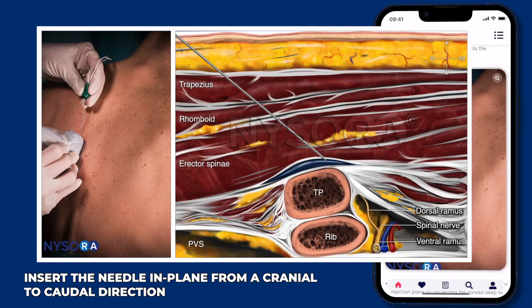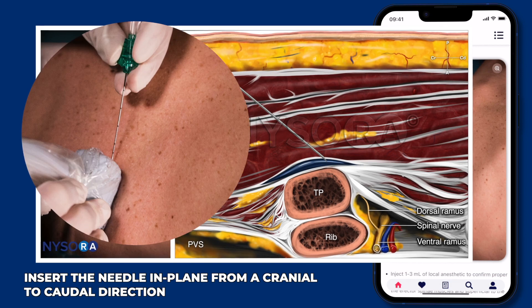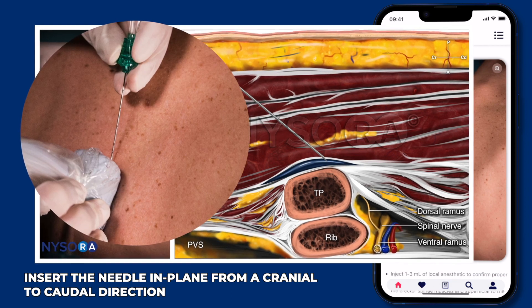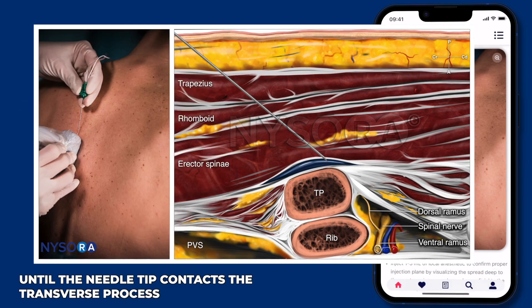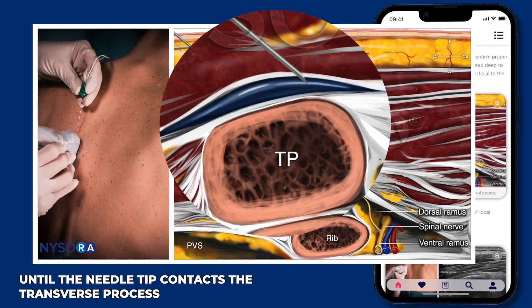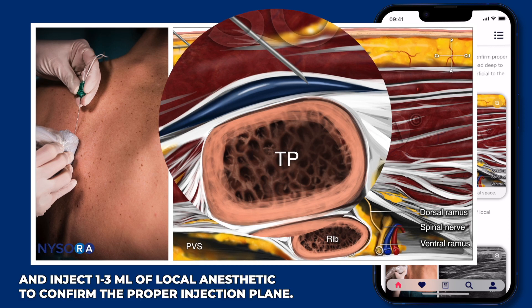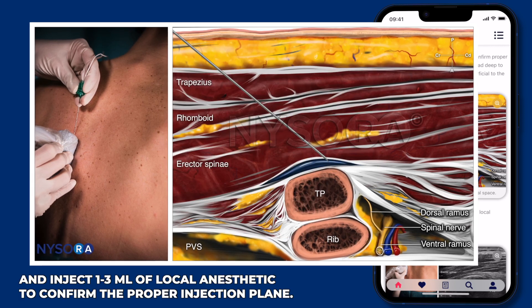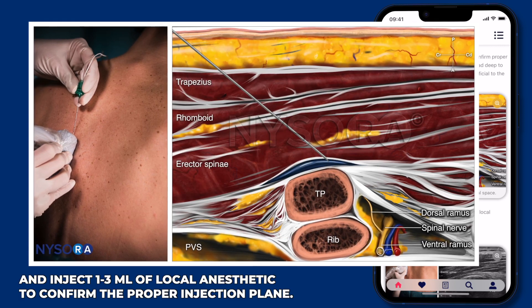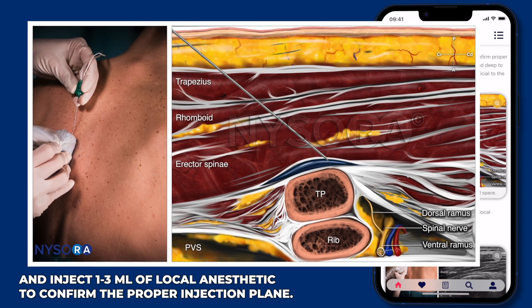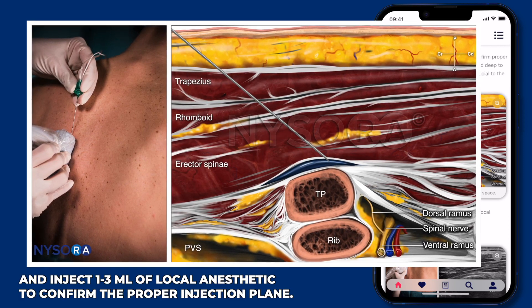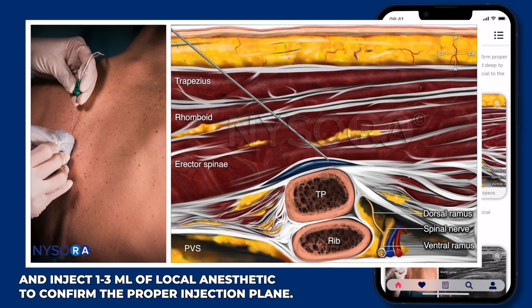Step two: insert the needle in-plane from a cranial to caudal direction until the needle tip contacts the transverse process, and inject one to three milliliters of local anesthetic to confirm the proper injection plane.